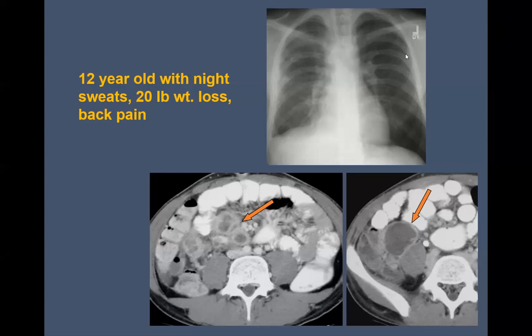Okay. I'm not sure if there's another X-ray question. Do you recommend, oh, did you answer the periodic chest X-ray question? Yes. Okay, so there was a similar one in the chat box. Do you recommend multiple chest X-ray evaluation during treatment? But it looks like it's the same person. Yeah, I think that was the question I just answered. Yes. Okay, and there are no more questions coming in at this time.